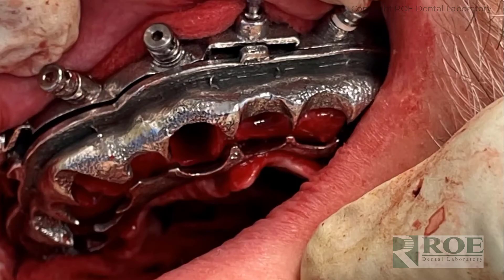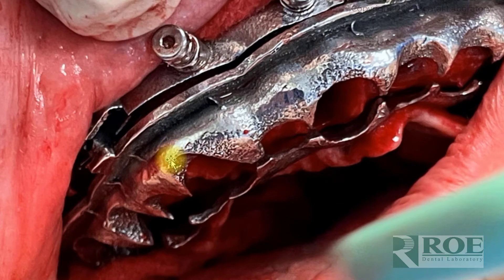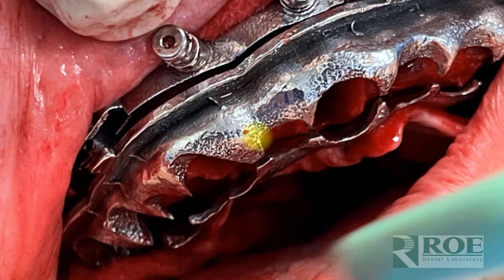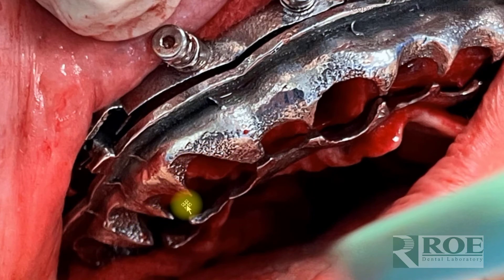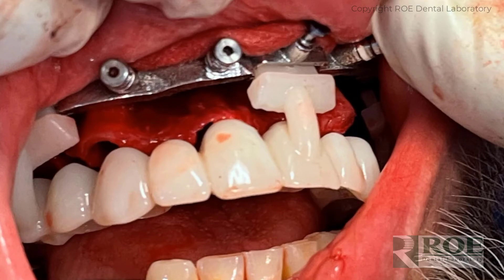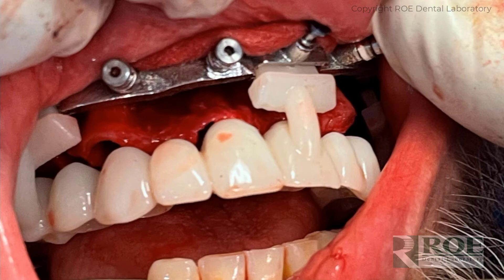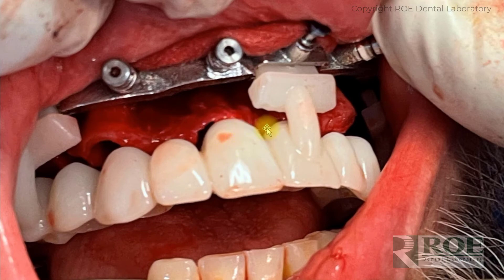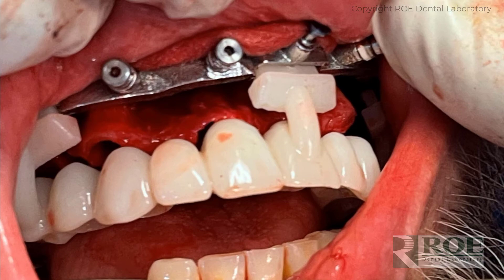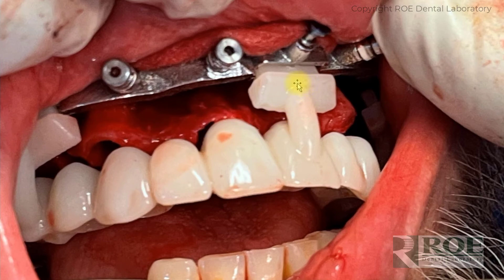Then the scallop guide is delivered. In this case the bone was holding it up a bit — the doctor adjusted the bone until it seated. Then, vertically from the occlusal, he made the ideal-size osteotomies following the marked-up socketed bone model. Little adjustments to the bone are made until the prosthetic seats passively. The prosthetic will be seated to verify passivity and may need a little bone adjustment. The goal is to have symmetrical architecture when adjusting, and that is how it's planned.